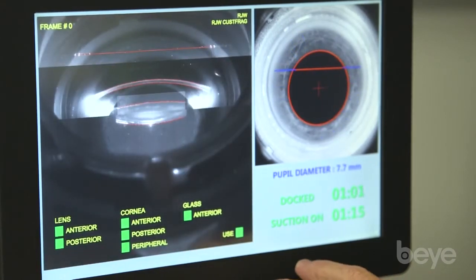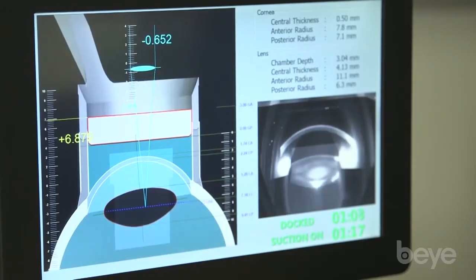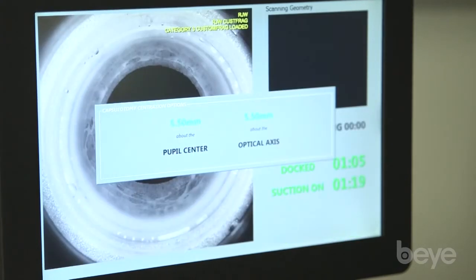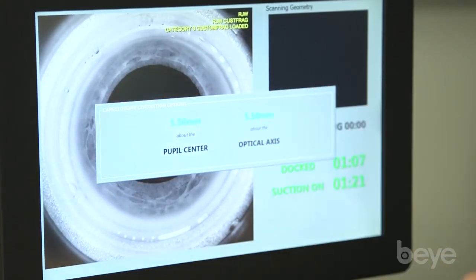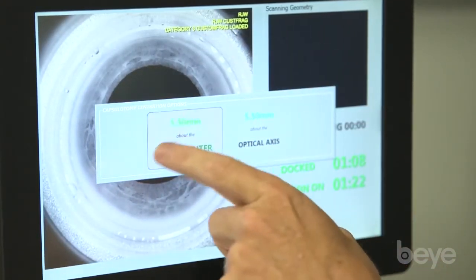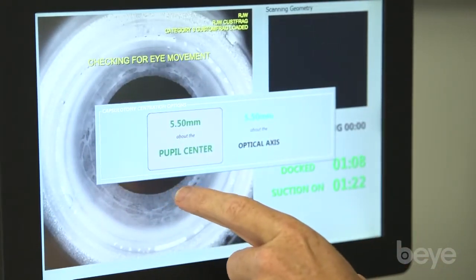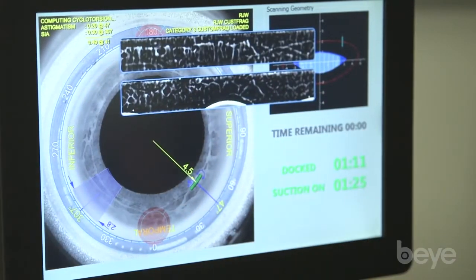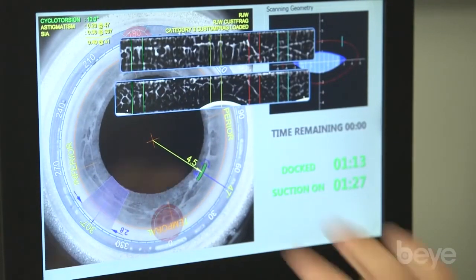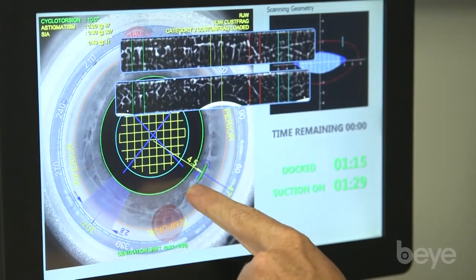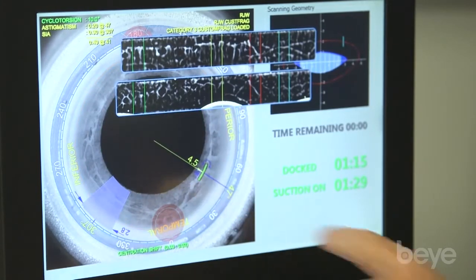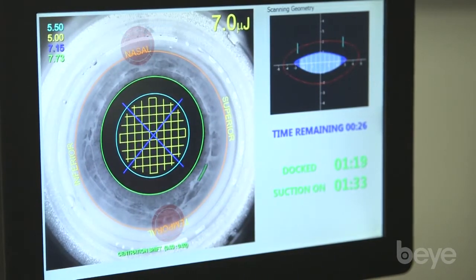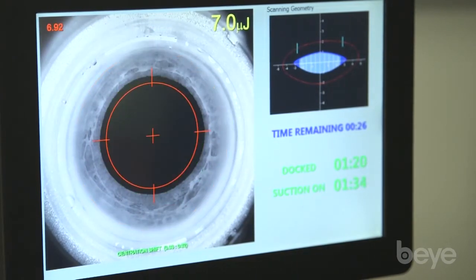You see right here — it's custom frag — and it's going to tell us right here. It gave us a category 3, so we know it's going to be a pretty good treatment. There's the iris registration now for the limbus. You saw that little shift — that LRI just moved from here to here, and that's from the cyclotorsion correction that we have in the Streamline software.